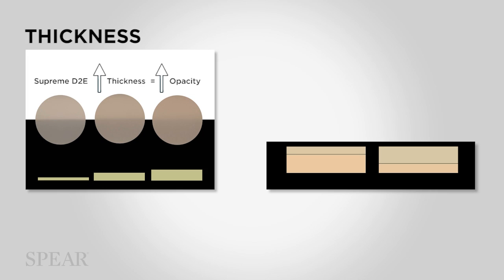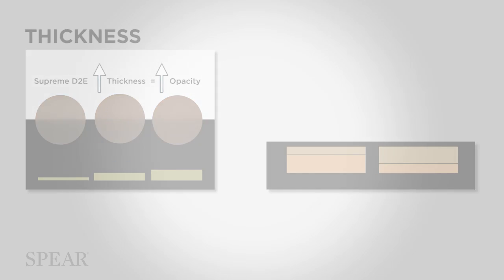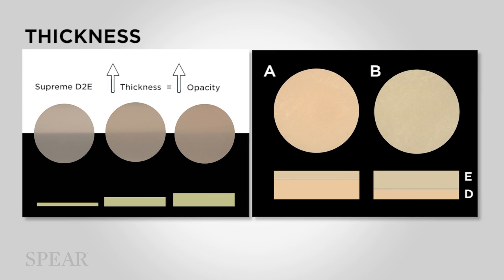I can layer a disc of 1 millimeter of enamel and 2 millimeters of dentin. Or I could layer a different one with a thicker enamel, 1.5 millimeters of enamel, and the same amount of dentin. If I look at them, the different thicknesses of the enamel layer, you will see different colors, different appearances, and that's also important.